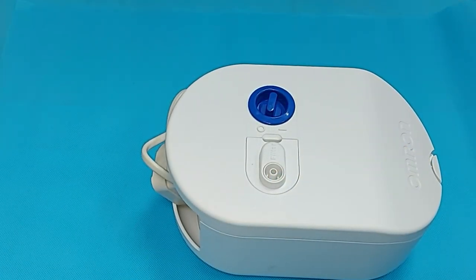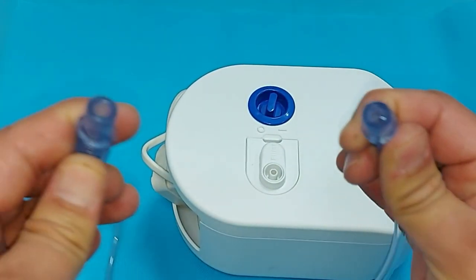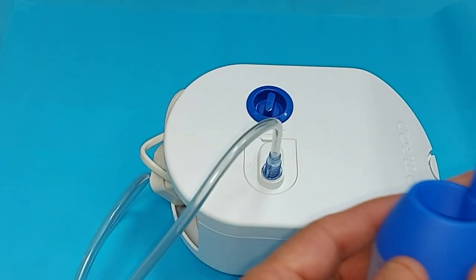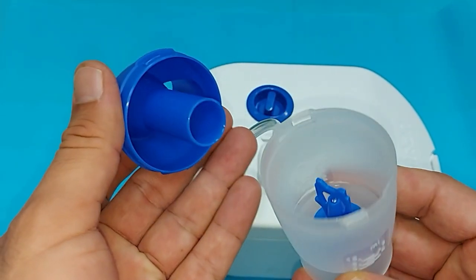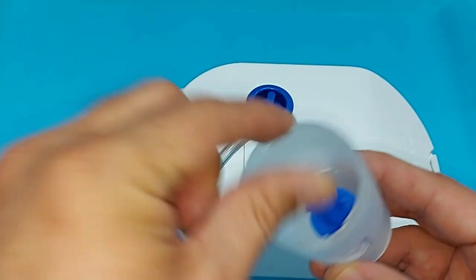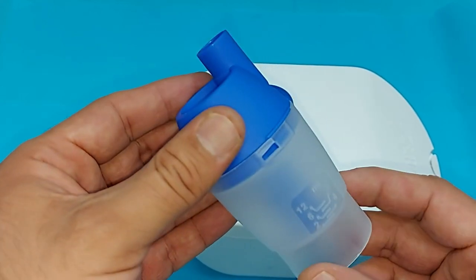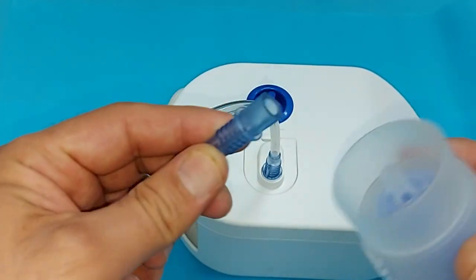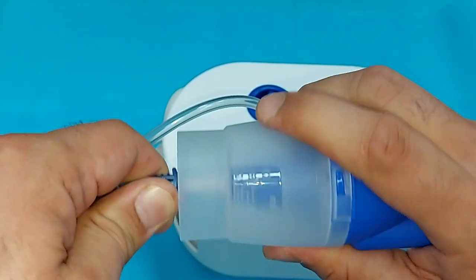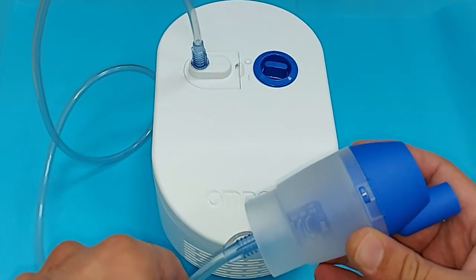Now we will set this device up for nebulization. Look carefully — you have to connect one end of the tube here to the compressor. This is your medication container, and here is a vaporizer head. Connect the other end of the tube here to the medication container, then mount the medication container onto the device. This makes it easy for you to put the medication in.